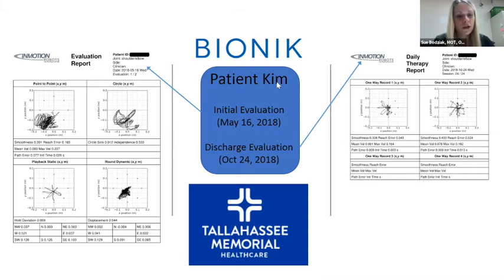And eventually she had a Medicaid insurance, and she was running out of visits. So this patient is really exciting. I ended up writing a pretty extensive report to her insurance company trying to get her more visits. I was able to print out these forms, and I wrote a report with them and sent them to her insurance company. And she was able to get 4 more visits, which wasn't a lot, but it was something. So it was exciting to see how these tools can actually help you to get more visits with your patient.